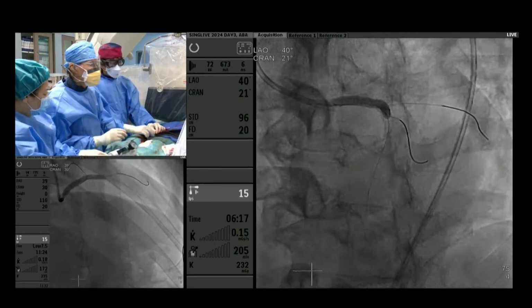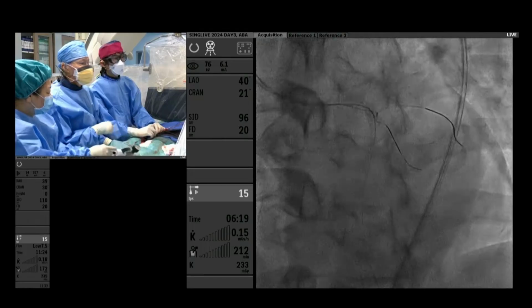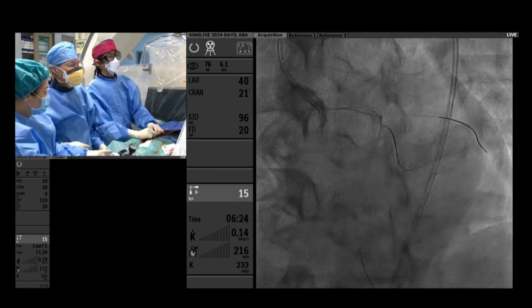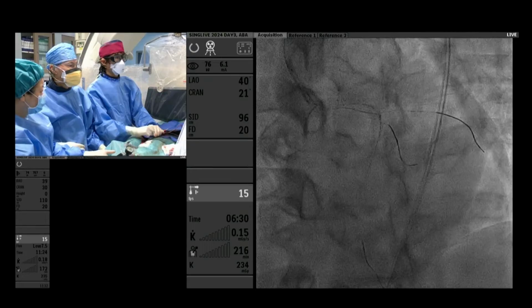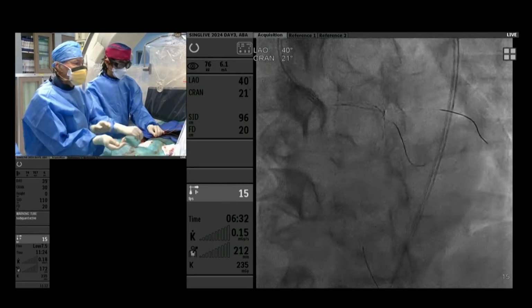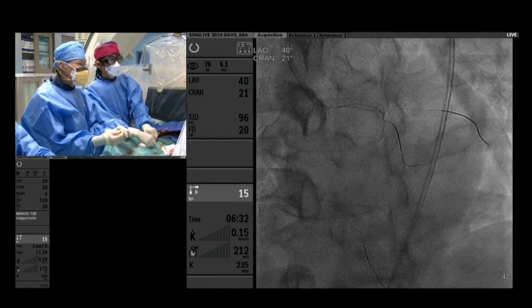No. It's just the stent balloon. Oh, the stent balloon. Okay. Down. Guide out, pull out the guide. So we are disengaging our guide as we remove the balloon, because right now we have a couple of trapped wires, we don't really want to deform the stents. Excellent. Yeah, the deformation effect is very unpleasant to manage.